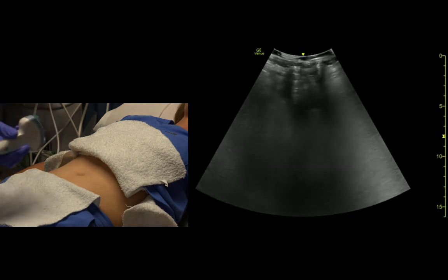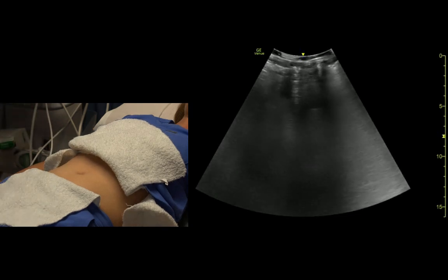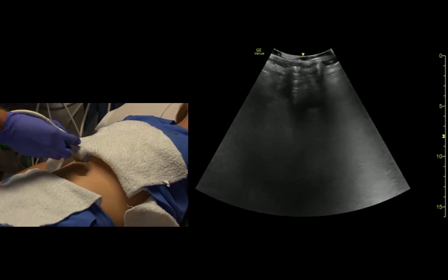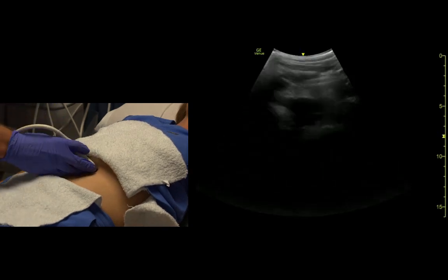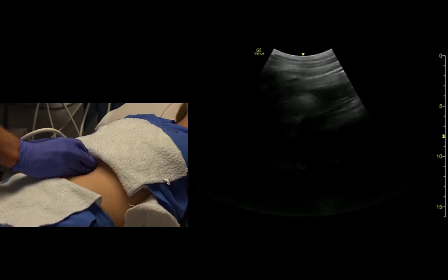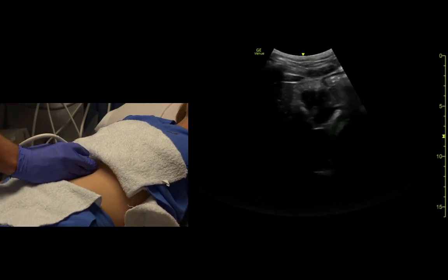We're going to start right pretty much in the middle of the abdomen, indicator towards the patient's right. We're in abdominal setting, using the curvilinear probe. And we're going to find the liver first.